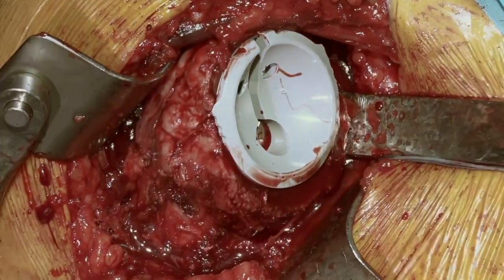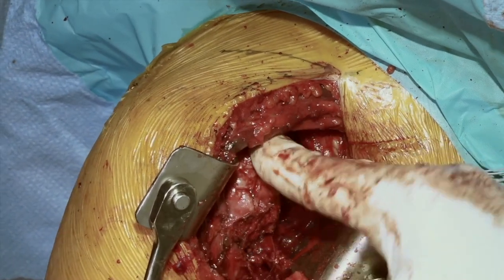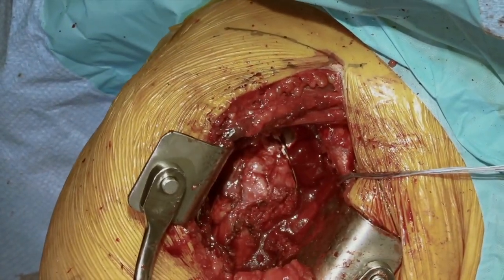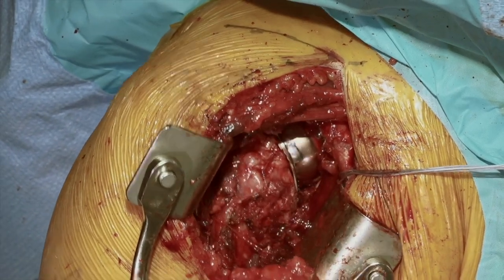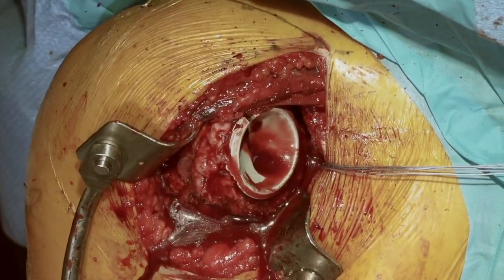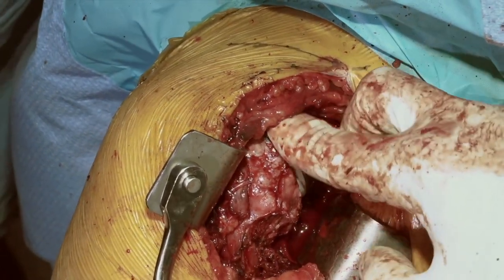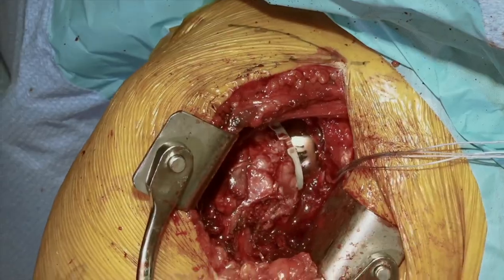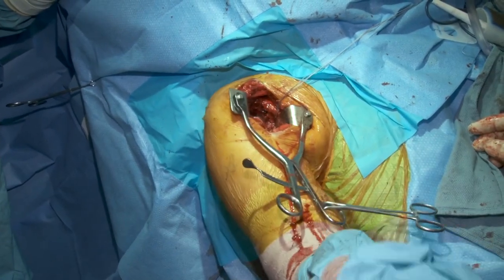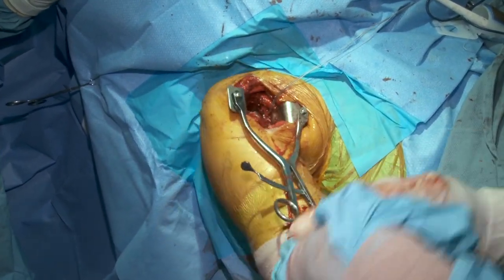We'll use this retractor as a skid to glide this in place. We'll take two fingers with a slight lateral displacement, push this lateral, and it goes in pretty gently and pops into place. For me this is not bad, but I think it's a little bit loose and I'd like her shoulder to be a little bit tighter — I think we can go up to a plus 6. Going to the plus 6, the maneuver is to glide this over the top of the glenosphere. That one came together very nicely and feels solid and secure. We have nice rotation — internal, external — and it's stable.